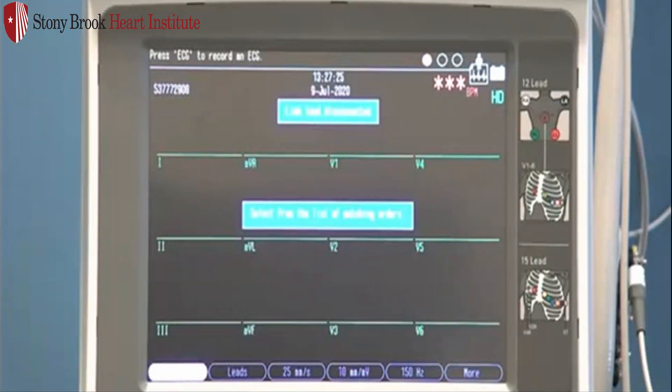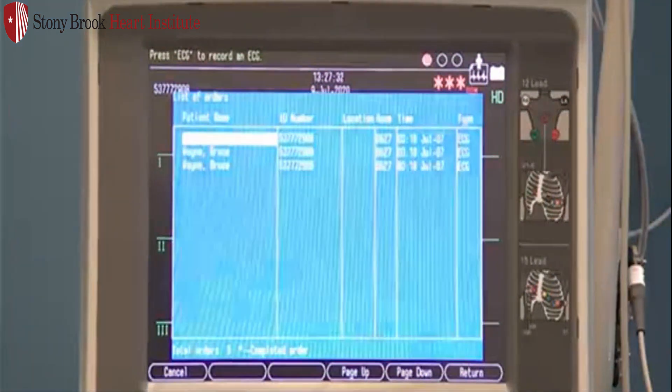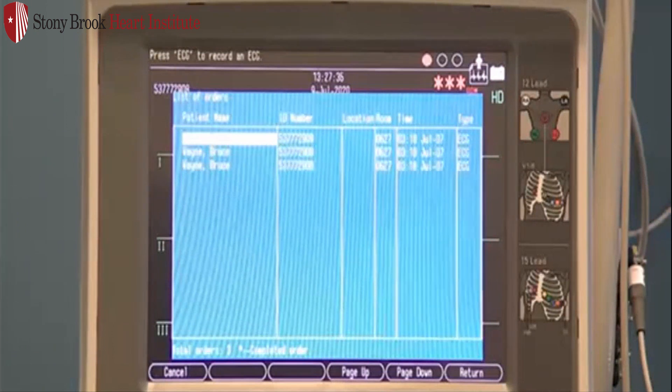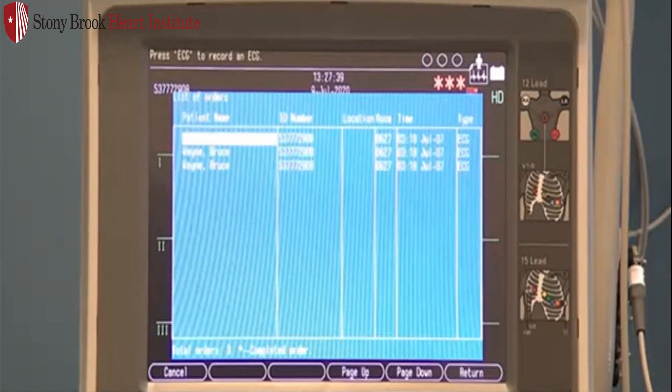The system is going to queue for your orders first. If there is an order, it'll populate the information. If there's more than one order, you'll have a list that appears here and you can select the appropriate order based on the timestamp. If there is no order available, the system will query for ADT information, which is your admission, discharge, and transfer information. That information will then populate as well.